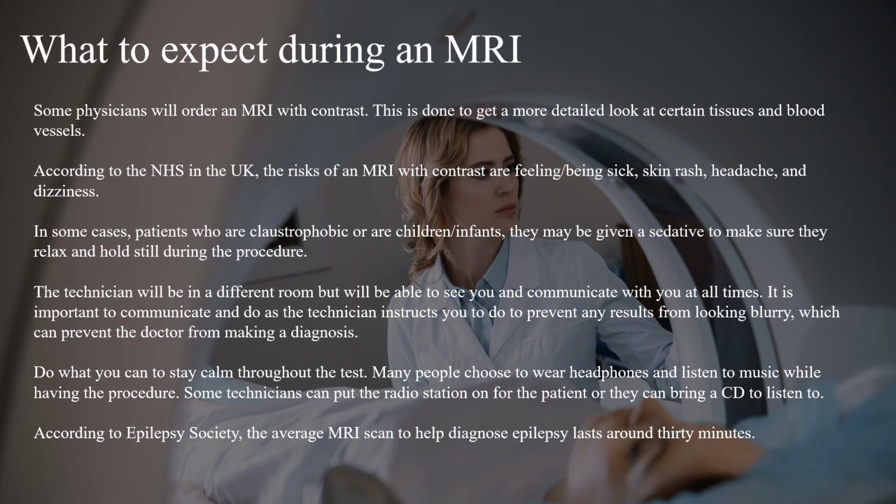The technician will be in a different room, but will be able to see you and communicate with you at all times. It is important to communicate and do as the technician instructs you to do to prevent any results from looking blurry, which can prevent the doctor from making a diagnosis. Do what you can to stay calm throughout the test.